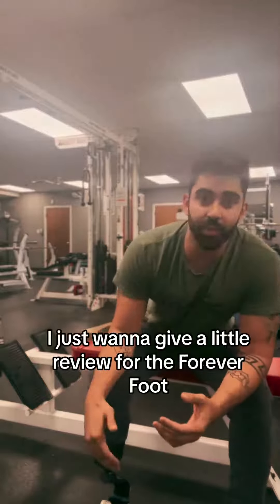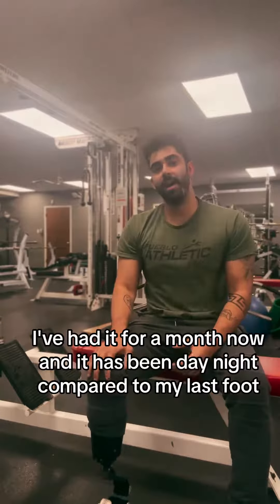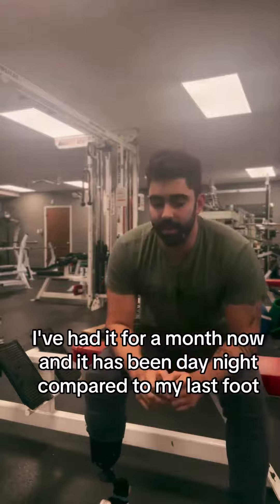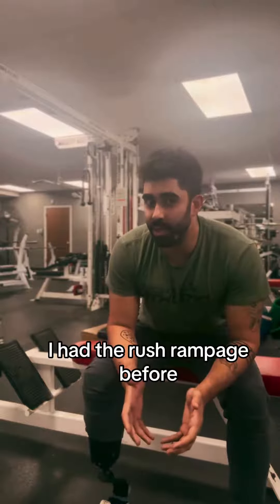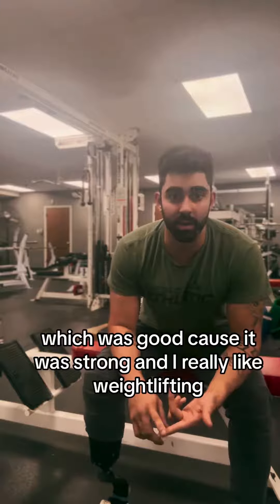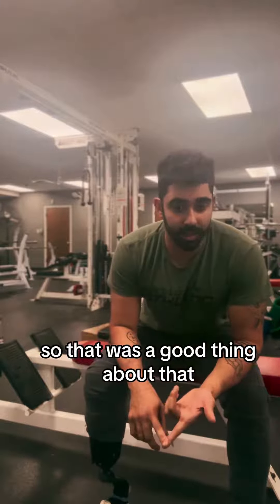My name is Darian. I just want to give a little review for the Forever Foot. I've had it for a month now and it has been day and night compared to my last foot. I had the Rush Rampage before, which was good because it was strong and I really like weightlifting. So that was a good thing about that.